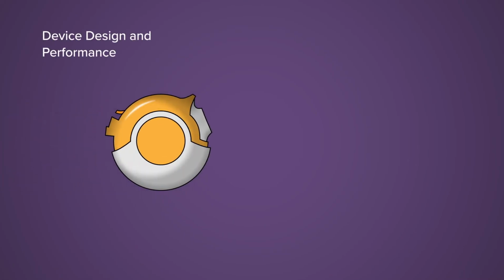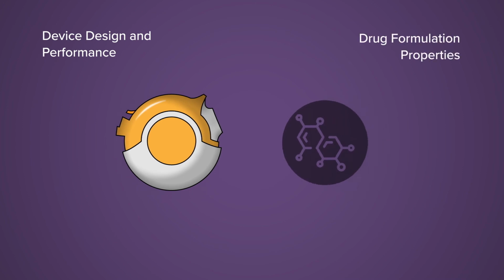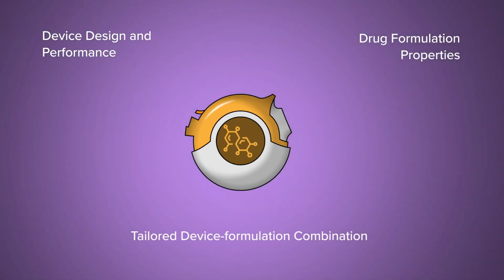The three considerations for efficient inhaled drug delivery that we discussed are device design and performance, drug formulation properties, and tailored device formulation combination.